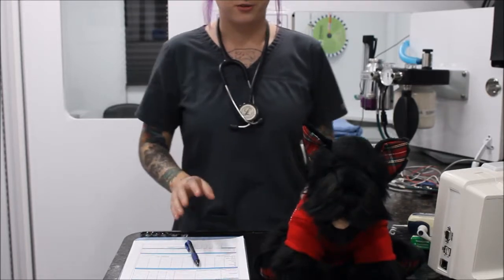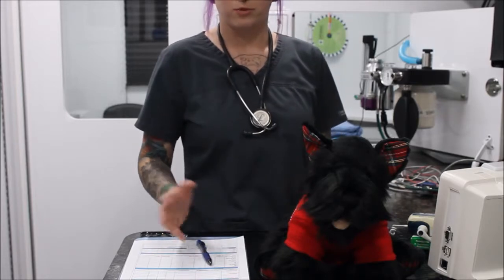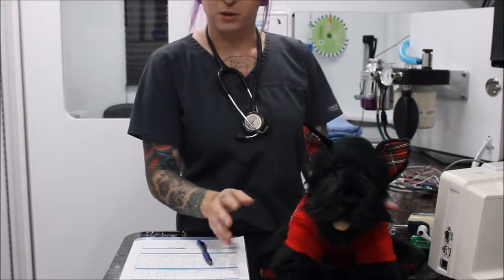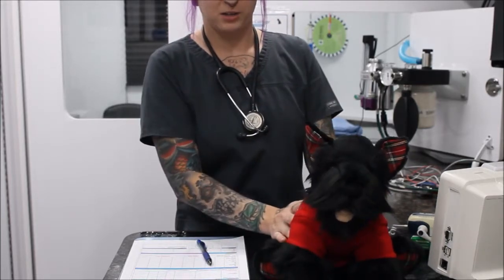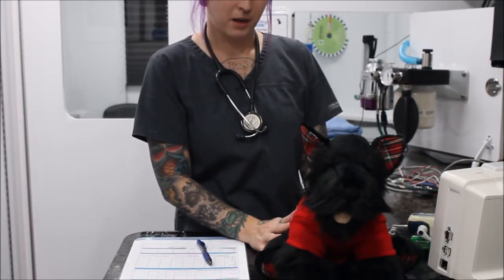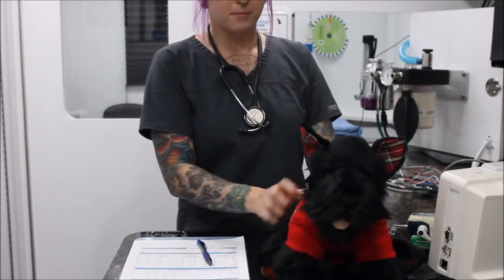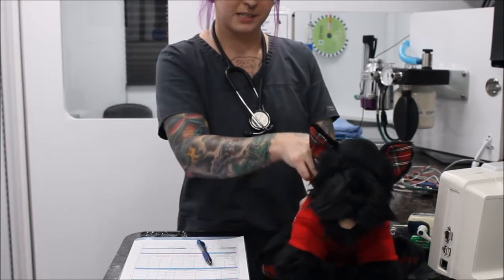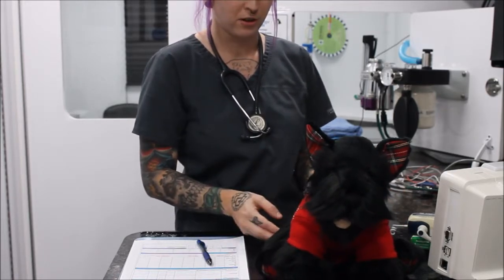The best way to monitor your patient under anesthesia is with your own hands, basically through direct personal contact. So with your eyes, your hands, your ears, basically everything you can, just so you have your hands on your patients. Sometimes, however, it's not always possible depending on the type of procedure that's being done. But we do have monitors that can help us as well in cases that we can't always have our hands on our patients depending on the type of procedure.